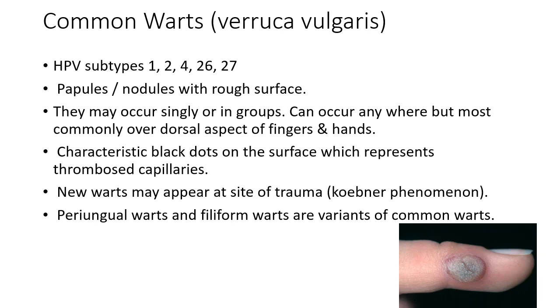The histological features of verruca vulgaris. The defining features are hyperkeratosis, papillomatosis, and hypergranulosis. There are columns of parakeratosis, especially over the projecting dermal papillae. Vacuolated superficial keratinocytes with pyknotic raisin-like nuclei, which are known as coilocytes. Coilocytes may not be seen in older lesions, so they are not always needed for the diagnosis.